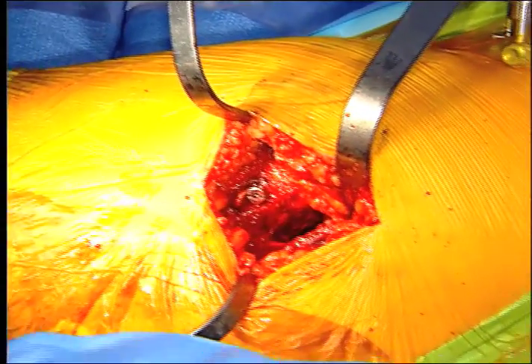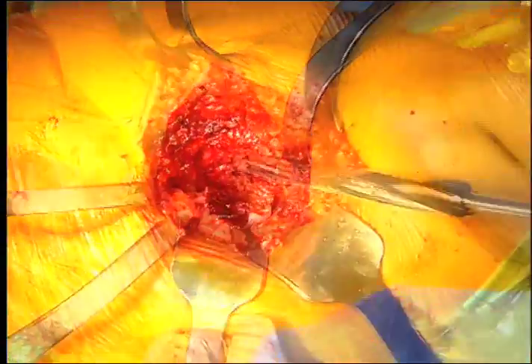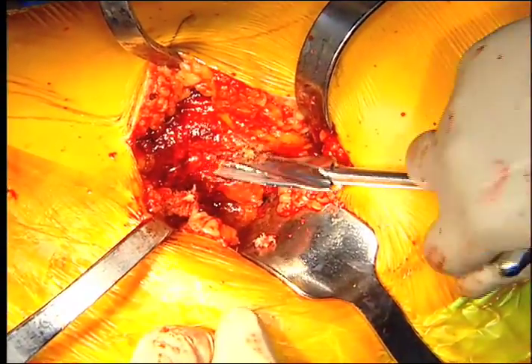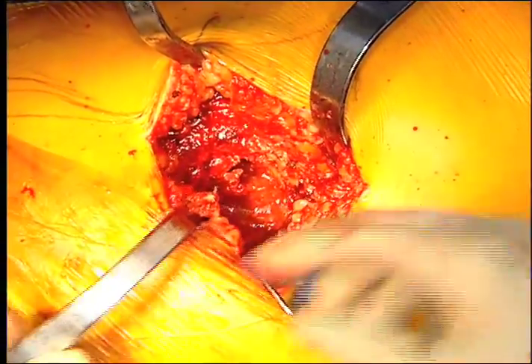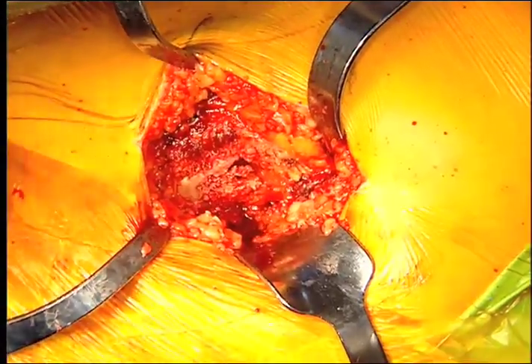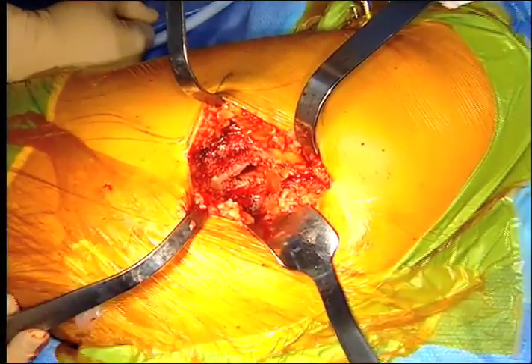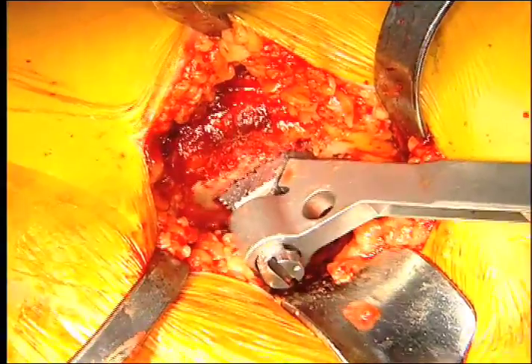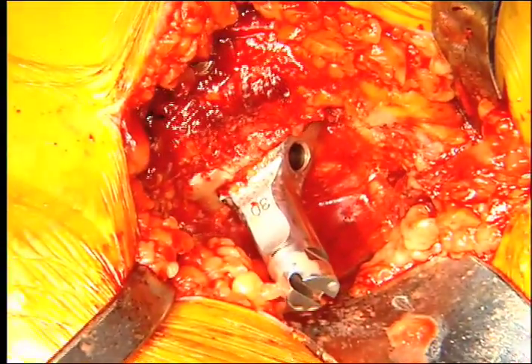With the neck cut done, we'll do the routine broaching preparation of the femur, putting retractors in for that. This tool nicely clears the lateral neck to help keep the stem out of varus. He's getting back into that cortical bone at the neck saddle. We can see the whole neck. We put a starter broach in and will progressively broach up to size. These broaches are compressing bone as they go down, making a nice snug fit throughout. We'll quit at a size 4.